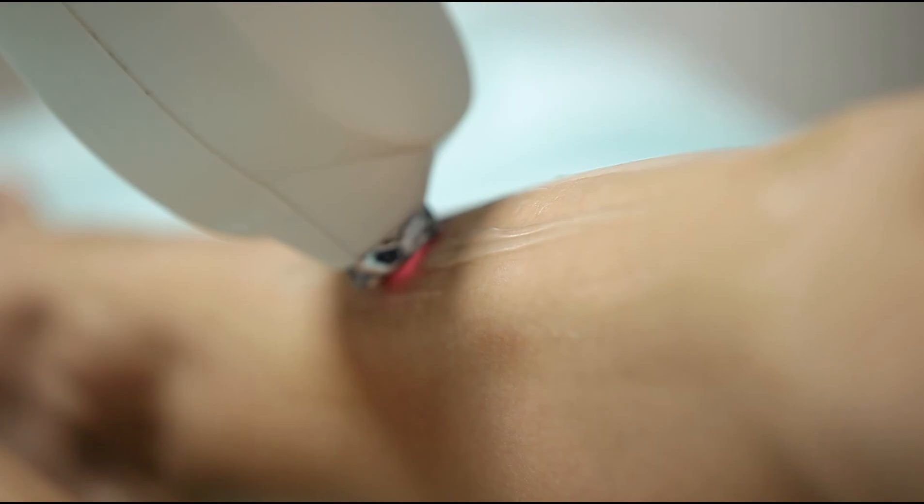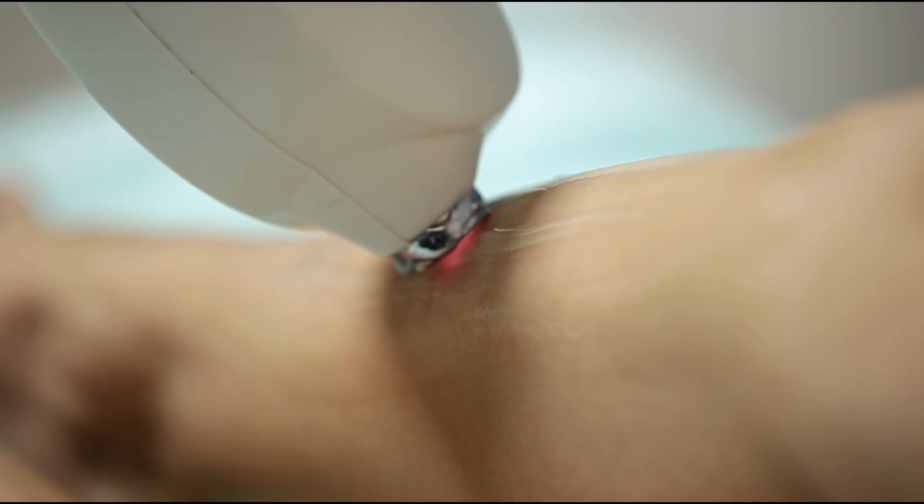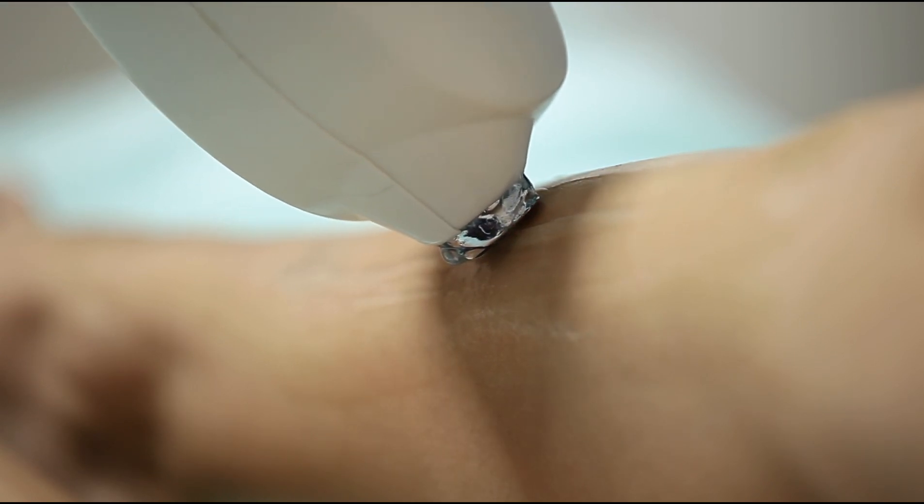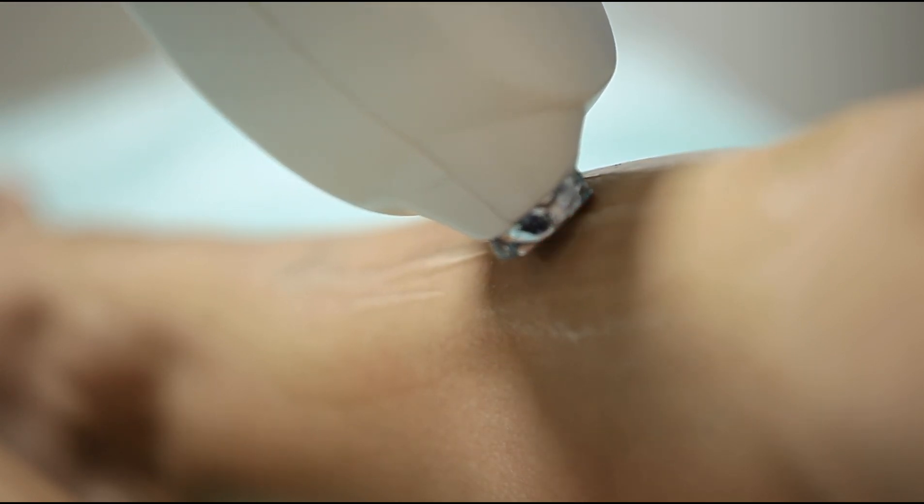IPL, intense pulsed light, is a technology that uses intense pulses of light to perform various medical and aesthetic skin treatments. The light source is typically a flash lamp such as xenon, and various manufacturers have their own unique protocols of spectral filtering, pulse timing, and beam delivery systems, all modified for specific types of treatment. IPL sources are not quite lasers.